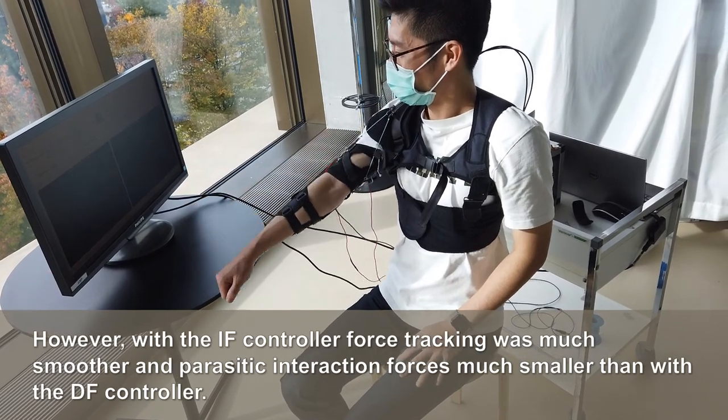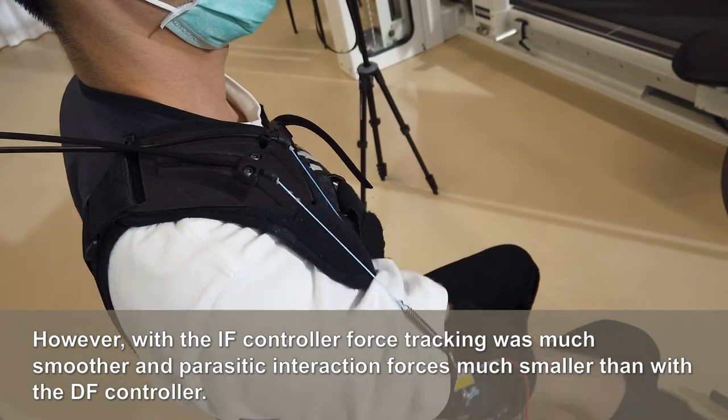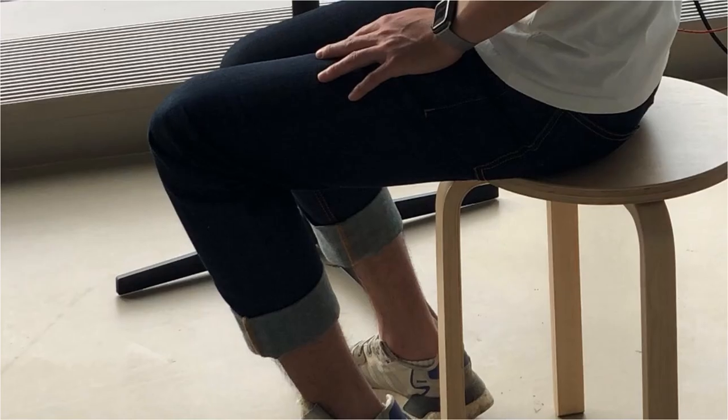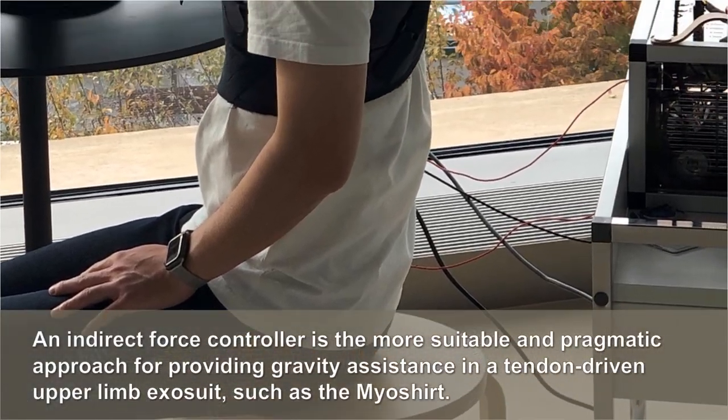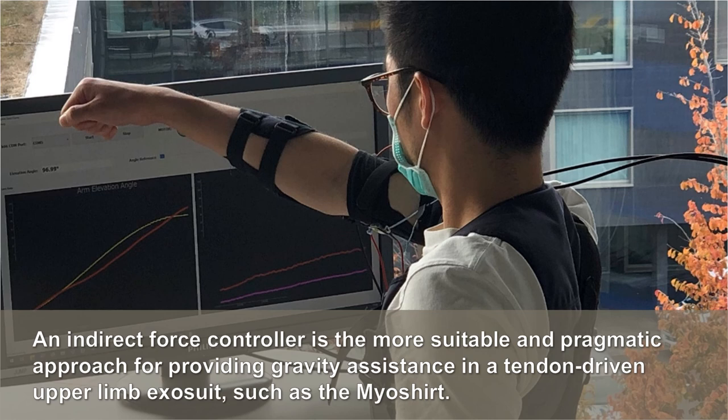However, with the indirect force controller, force tracking was much smoother and parasitic interaction forces much smaller than with the direct force controller. In conclusion, an indirect force controller is the more suitable and pragmatic approach for providing gravity assistance in a tendon-driven upper limb exosuit, such as the Myoshirt.